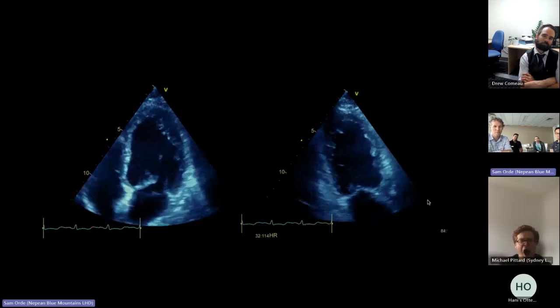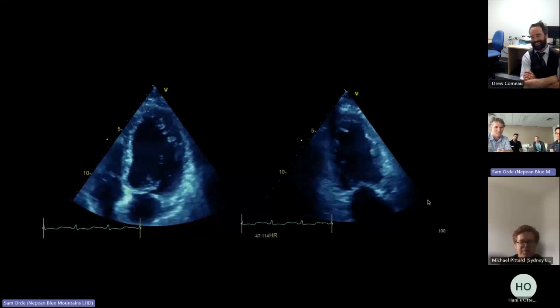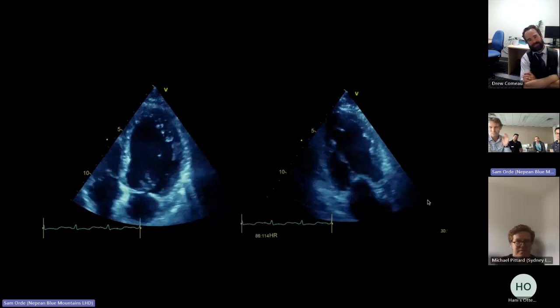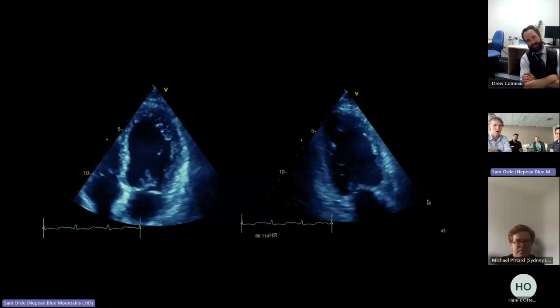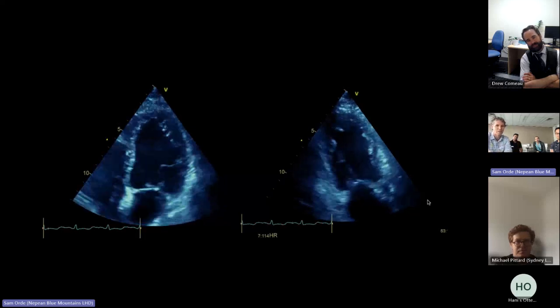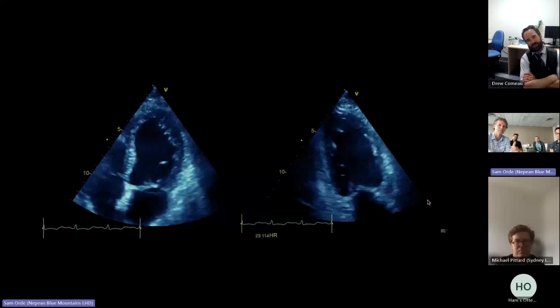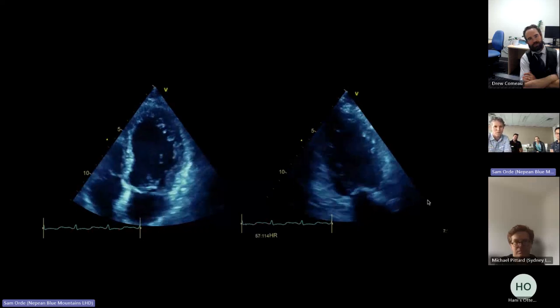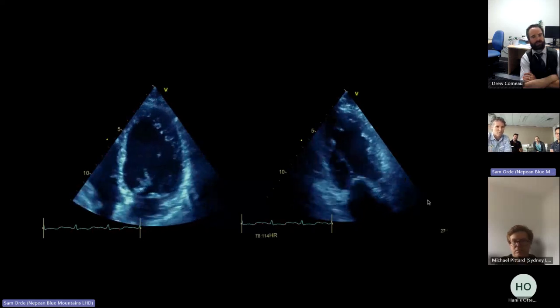I also think it's really cool and makes nice pictures, and it's really amazing science and a good way of using echo. And it is safe, but you do have to worry about causing hypotension and anaphylactoid type reactions. But as I said, I think it's relatively safe. It's non-invasive. I've found it useful at times. It's not all the time, but I have found it useful at times.